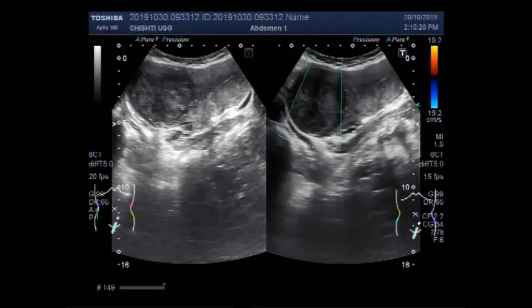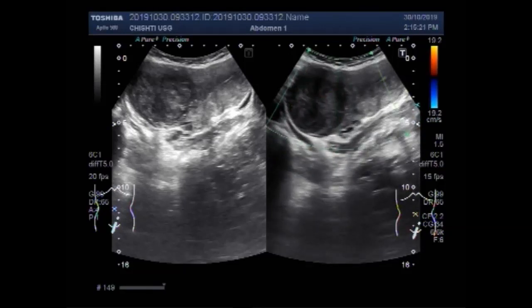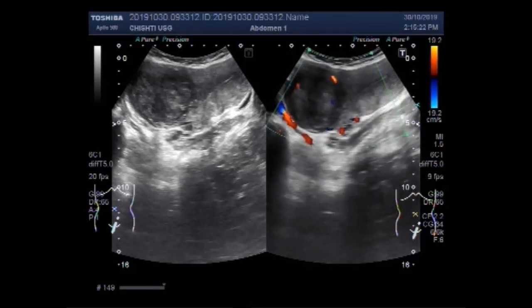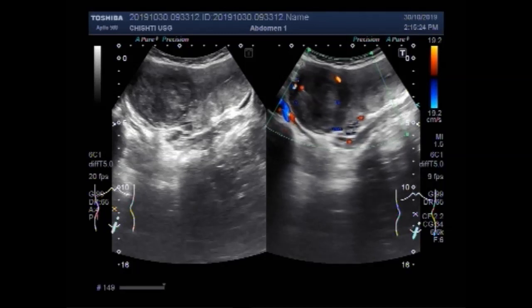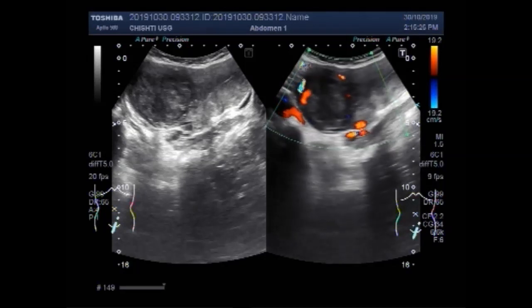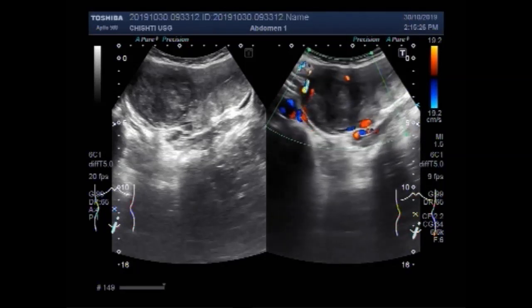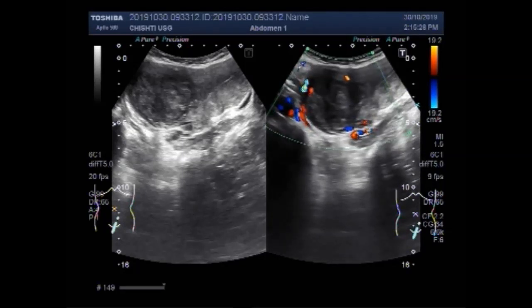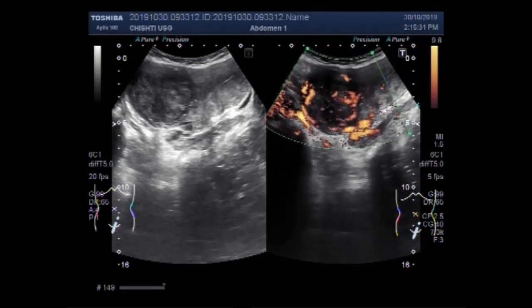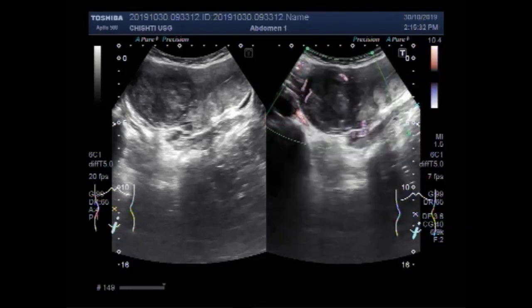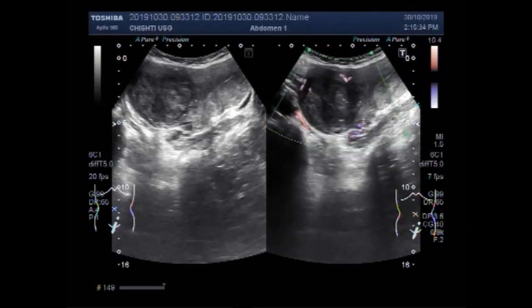Now you can see the blood flow, and slightly increased blood flow is seen inside the mass.